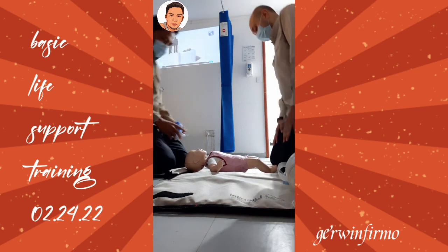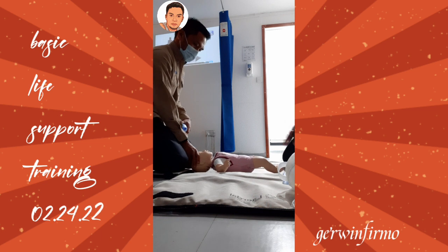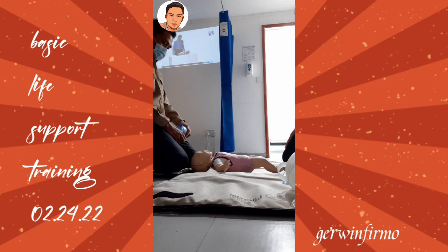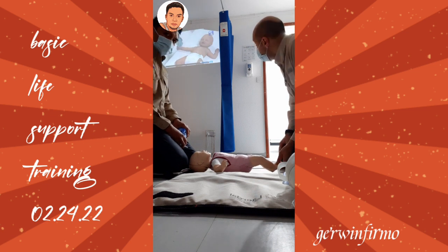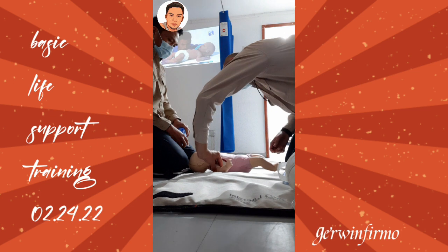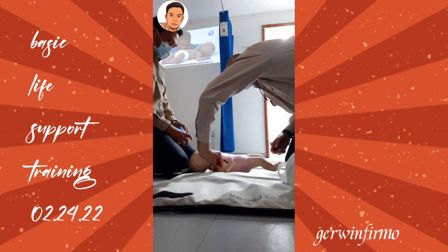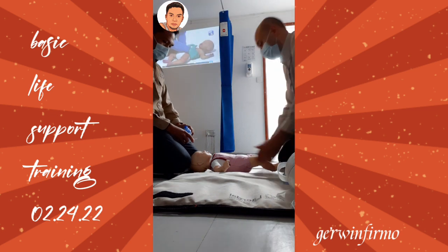Here we go in 3, 2, 1. Check responsiveness. Stay safe. Safe. Hey, are you okay? Are you okay? Check pulse. 1 and 2 and 3 and 4 and 5. No pulse. Activate the emergency response and get an AED. There is no breathing and no pulse.